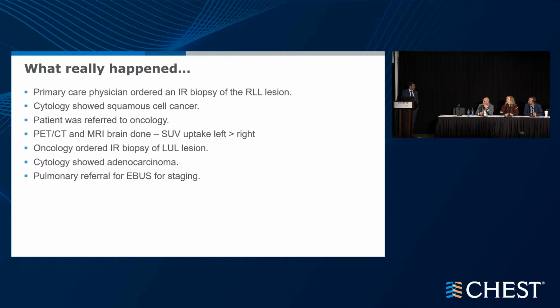Before you surprise us with the mediastinum, I surely hope that that's sarcoid and you're dealing with two primaries and you went for curative intent treatment for both lesions. But that will bring up the question of doing the CT-guided biopsy.